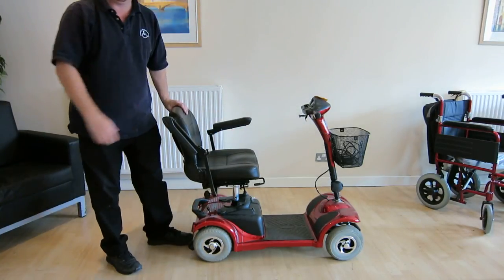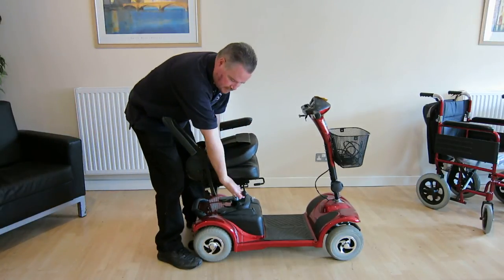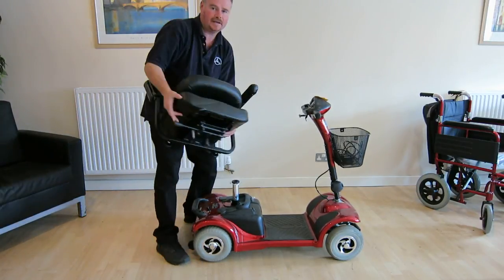First things first, lift up the armrests, seat back down, push this lever forwards and lift the seat up.